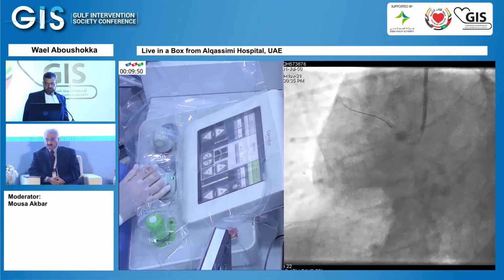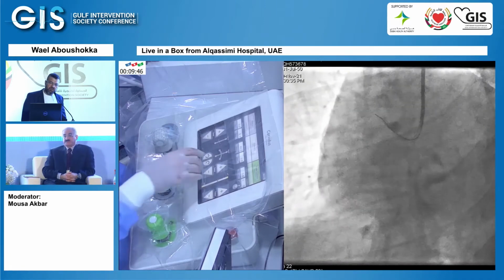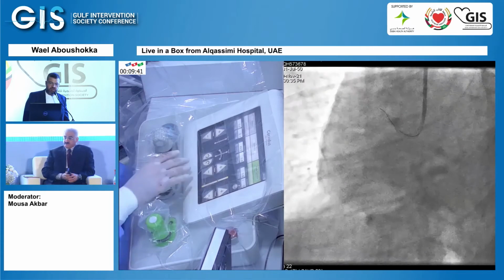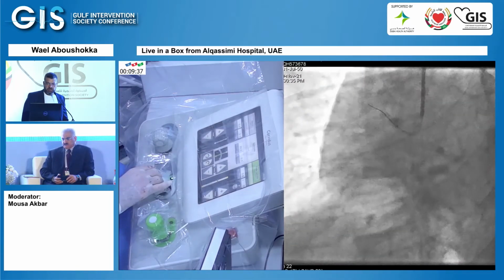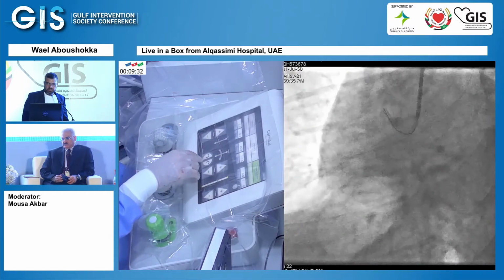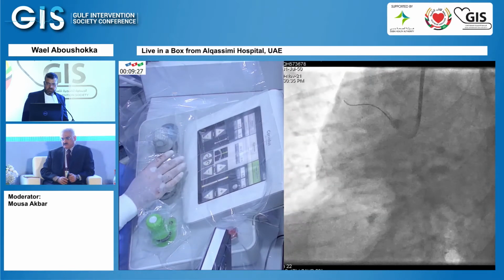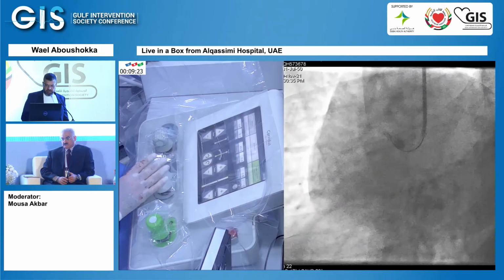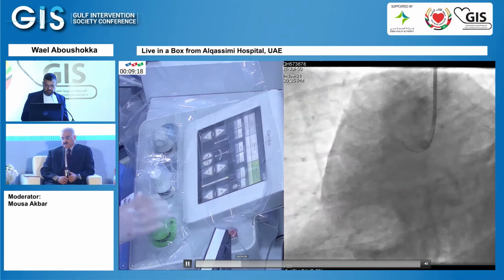Still we are going. Sometimes it's because of the curve of the wire, but actually, we didn't need to change the curve here. So we can skip it and try to go a little bit, small test.